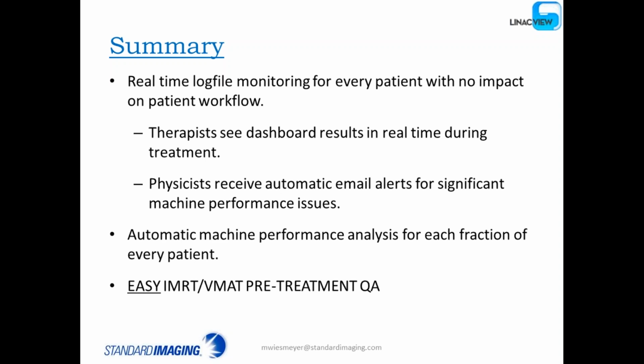That's done once. You would do that anyway, perhaps something similar to that if you're going to do pre-treatment QA with a MapCheck. And then at the treatment console, you really have the option of having a therapist watching in real time, or if you don't have that, there's absolutely no impact on their workflow.